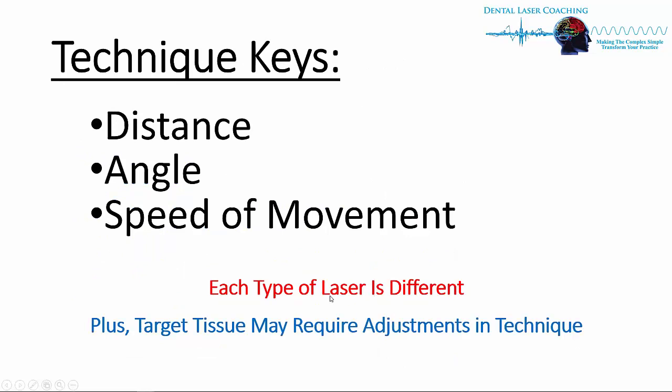But here's the key. Each type of laser is different. I can't give you one answer for every type of laser. Each one requires a little bit different distance, angle, and speed of movement, and then a little bit different distance, angle, and speed of movement depending on the structure that you're in. So it's not dramatic. It just takes some time to learn that.